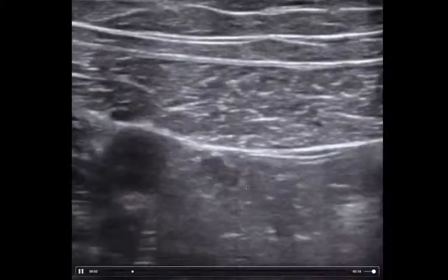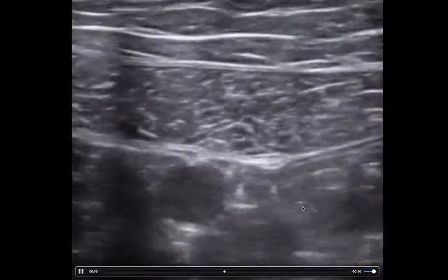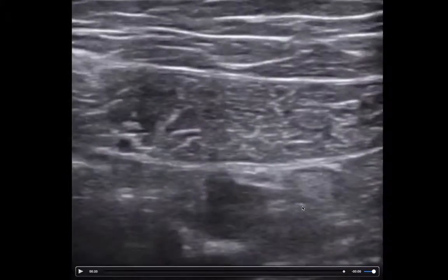And this is small bowel over here. So you'll see some bowel peristalsing with some particulate matter inside of it. Also, you might see an air pattern that's a little more like what the lung looks like. So you'll see a nice white hyperechoic line with a few A lines below it. I'll be honest, this transition between the two is very difficult to find, and I actually have a hard time finding it. But if you really need to figure this out and you don't have access to a radiology performed ultrasound or a CT scanner, this might be an option for you.